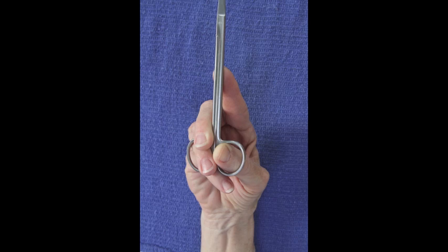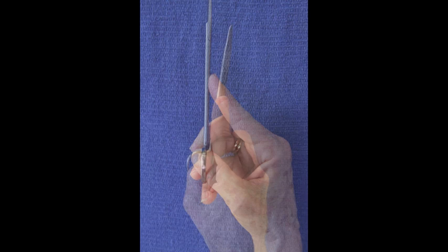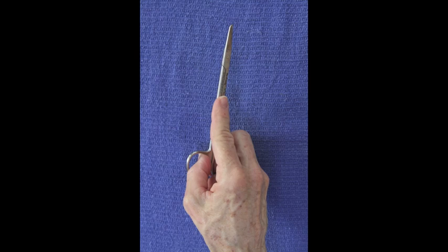In this way, the thumb and the ring finger are supporting the rings. The middle finger is supporting adjacent to the ring. And then lastly, the forefinger is up on the side of the instrument to give it stability. This is critical in order to be able to adequately hold or manage the instrument in the surgical environment.